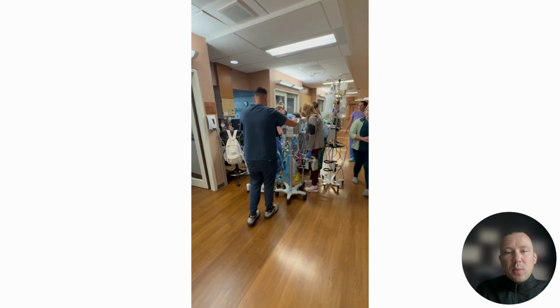This is a patient with an endotracheal tube who is walking in the hallway with assistance of respiratory therapists, nurses, and other staff, of course. To achieve this, we needed to do a lot of education and work on our end to bring the team together, have a buy-in from nurses, and make sure that everybody's on board with this intervention, which seemingly is very unsafe, as the endotracheal tube is potentially at risk of migration in this patient.